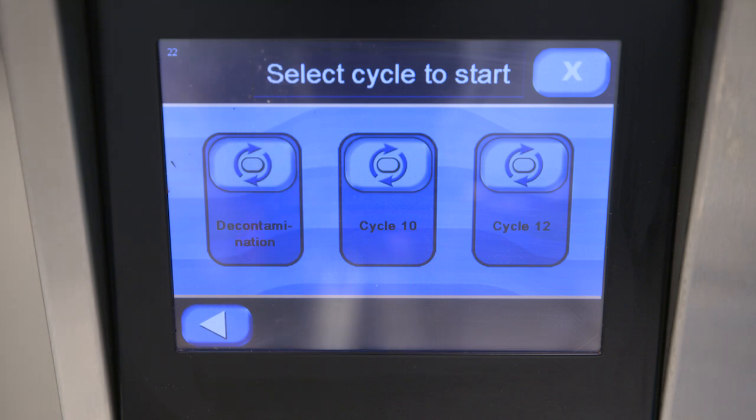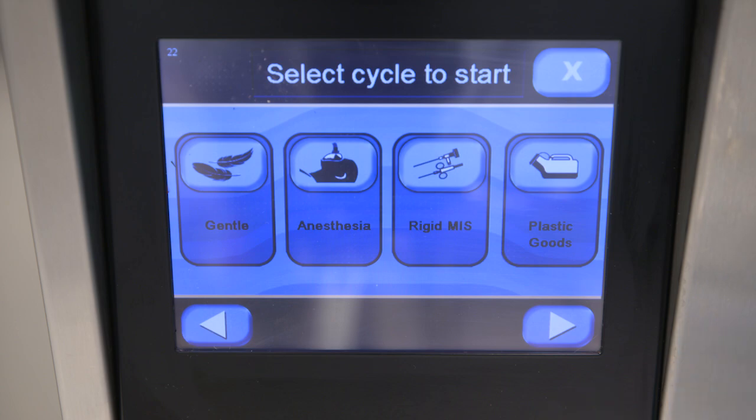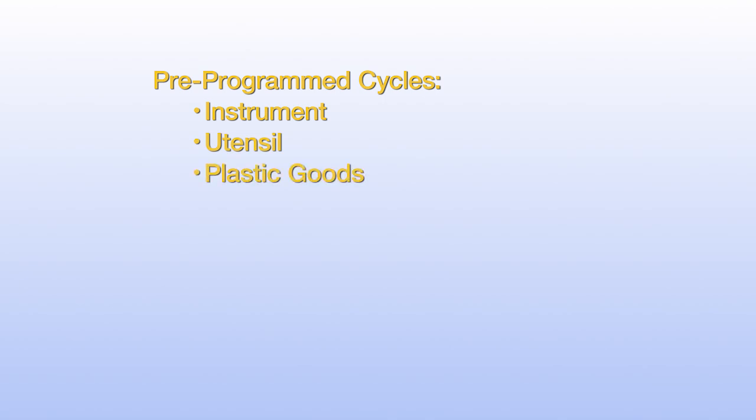The control system monitors operation of cycles and all critical cycle parameters. This washer can process a wide variety of loads using pre-programmed cycles and also allows for custom cycles. Pre-programmed cycles include instrument, utensil, plastic goods, gentle cycle, orthopedic, MIS, and anesthesia.